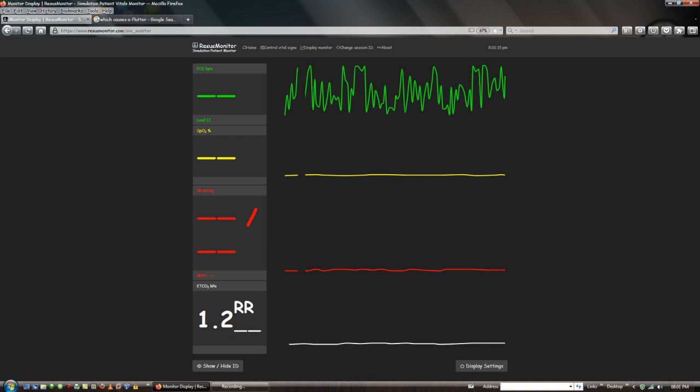It needs defibrillating and shocking, and even basic CPR and even advanced life support, ACLS and AED functions, or a basic defib with paddles if available. But I think an AED is recommended, and this EKG rhythm is caused by cardiac arrest. Now, what happens during cardiac arrest?